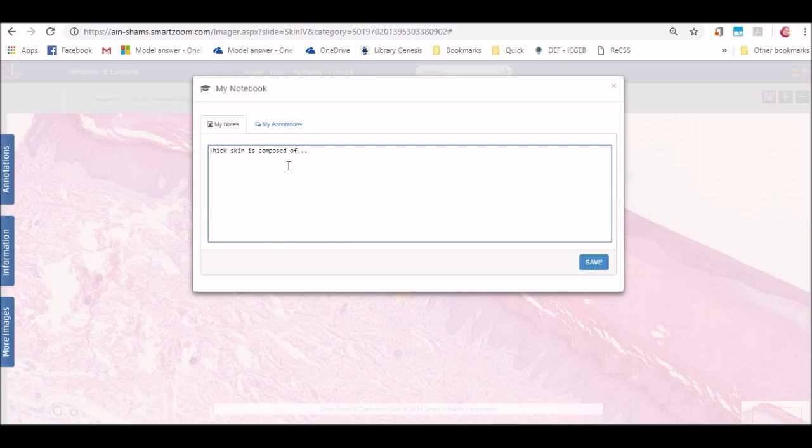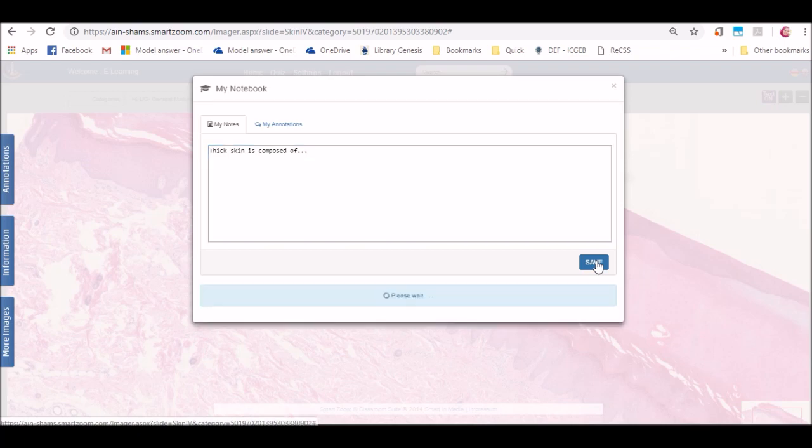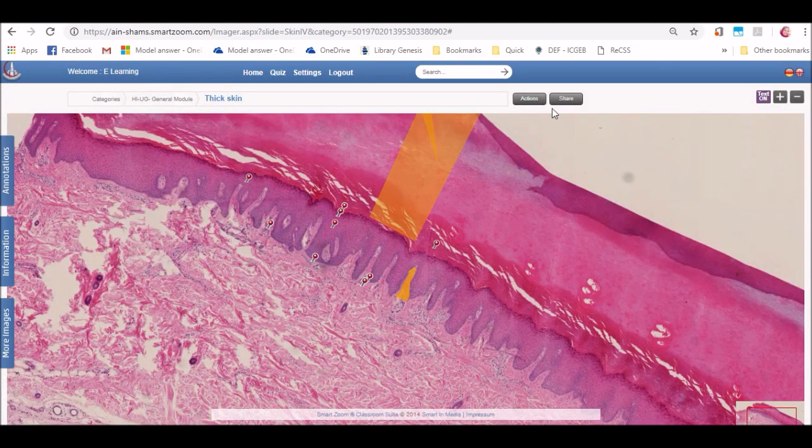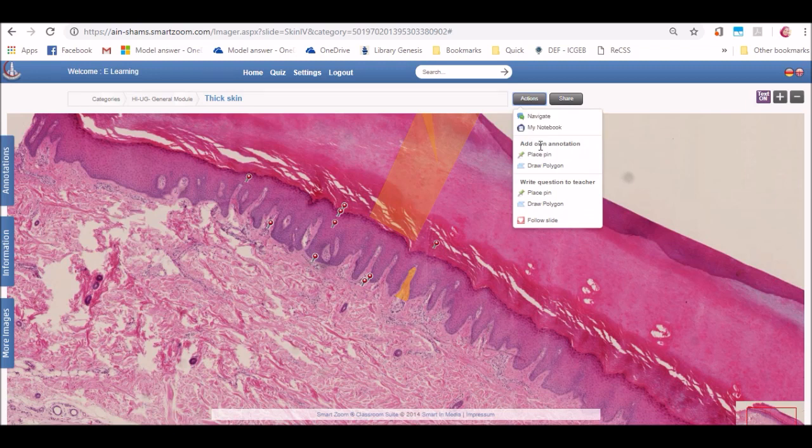The second feature is my notebook. My notebook is a site where you can type in all your notes according to your studying and to save them to look at them later when you open the same slide again.